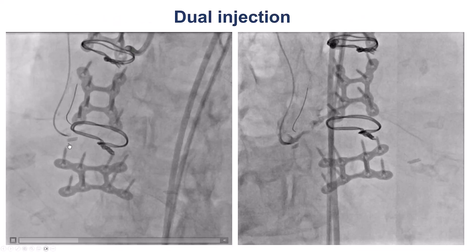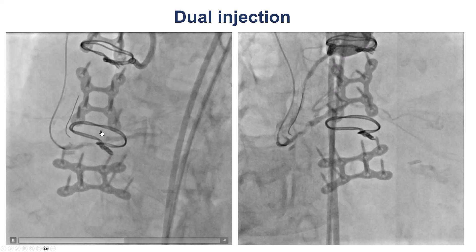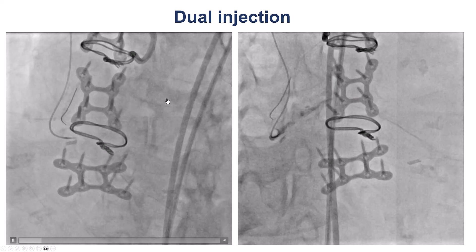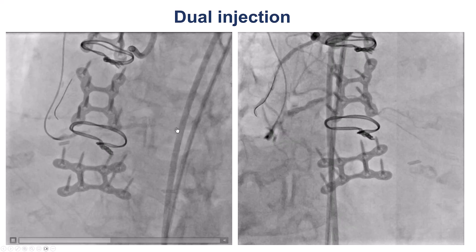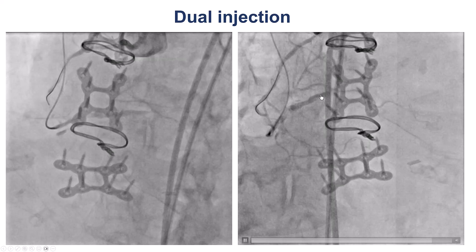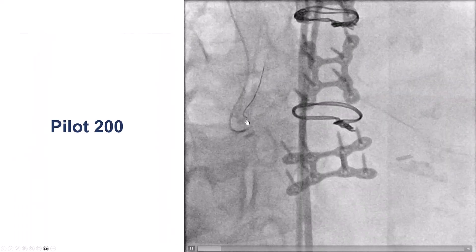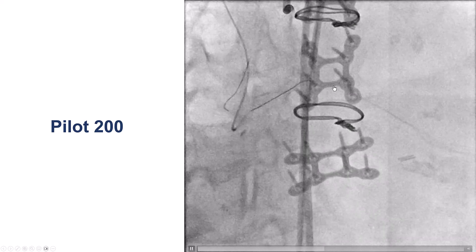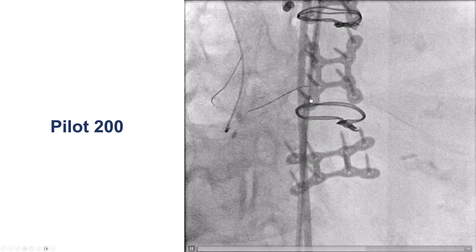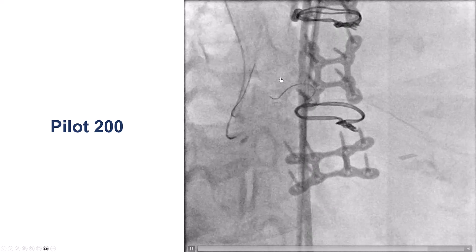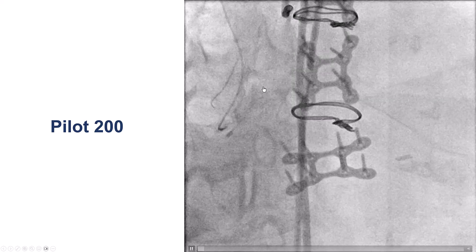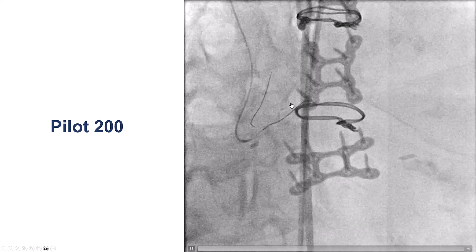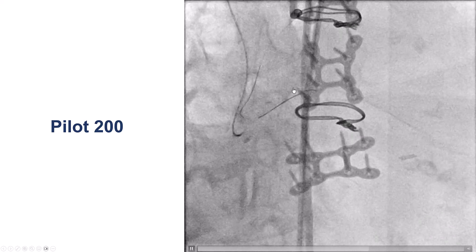We advanced the Corsair and then did an injection through the Corsair tip injection, showing the PDA and the posterolateral. There is a bifurcation on the distal cap right here. We then inserted a Pilot 200 guide wire that went through the vein graft into the native vessel, and we are now trying to go retrograde to reach the distal cap of the CTO.